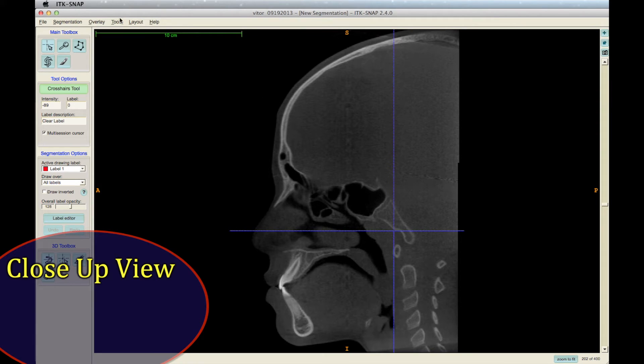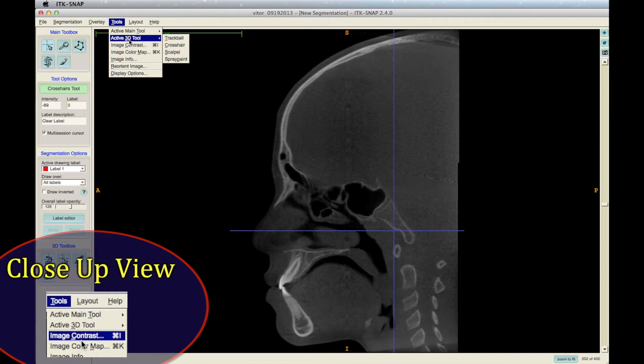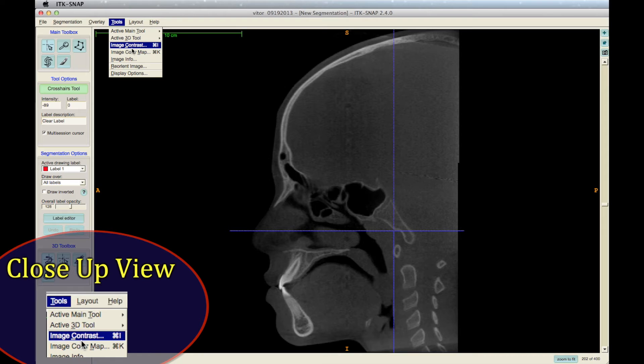Other options are available. For example, you can change the contrast from the Tools drop-down menu.